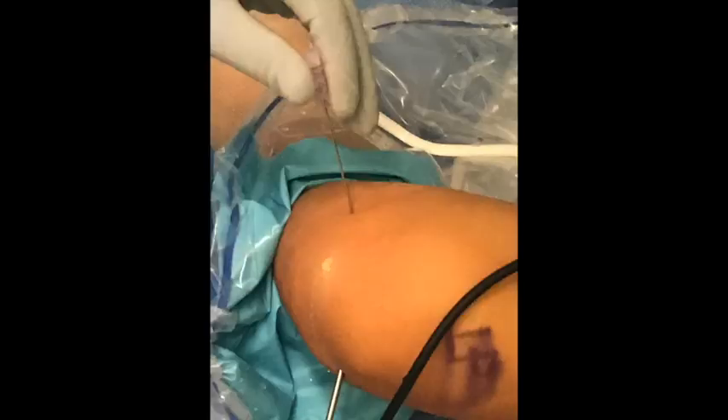Next, an accessory far medial portal is established just anterior to the medial femoral condyle under spinal needle guidance. This allows perpendicular access to the more anterior aspect of the meniscus and intrasubstance tear.